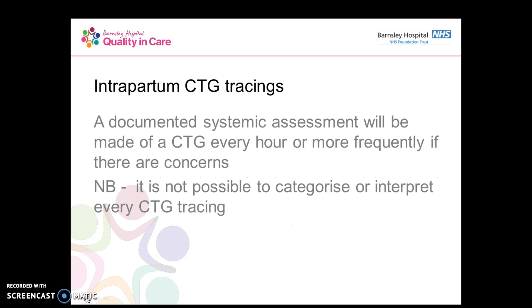So we need a documented systematic approach to interpretation of CTG so that everybody's on the same wavelength, like ourselves and medical staff are all following the same parameters. But when you're interpreting CTGs, always keep it in the back of your mind that not every single CTG that you have is going to fit neatly into these little boxes, and that you might not be able to interpret every CTG that you see. But if you're worried, then you must ask obstetricians to have a look and come to a consensus between you about what's happening to this baby.